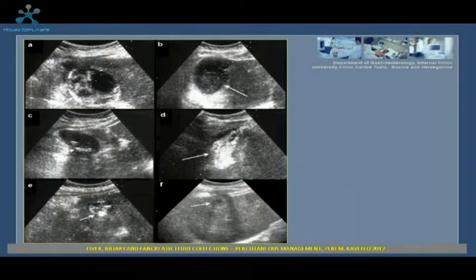but I include this slide, and this is the presentation of percutaneous management of acute perforated calculous cholecystitis with a large abscess collection in the right upper quadrant of the abdomen as definitive treatment.